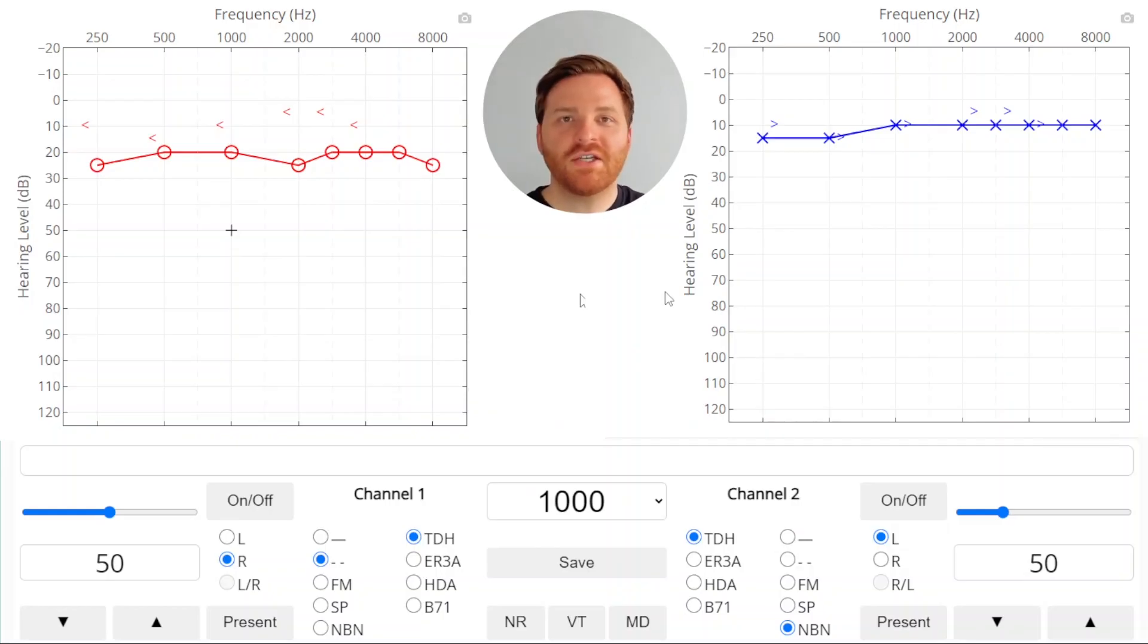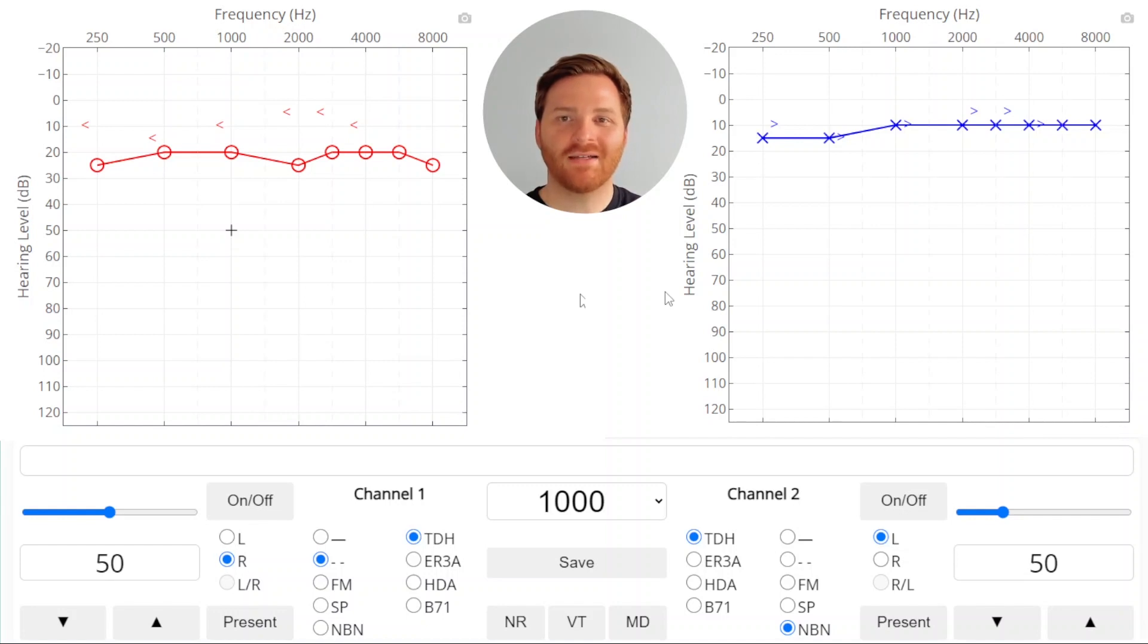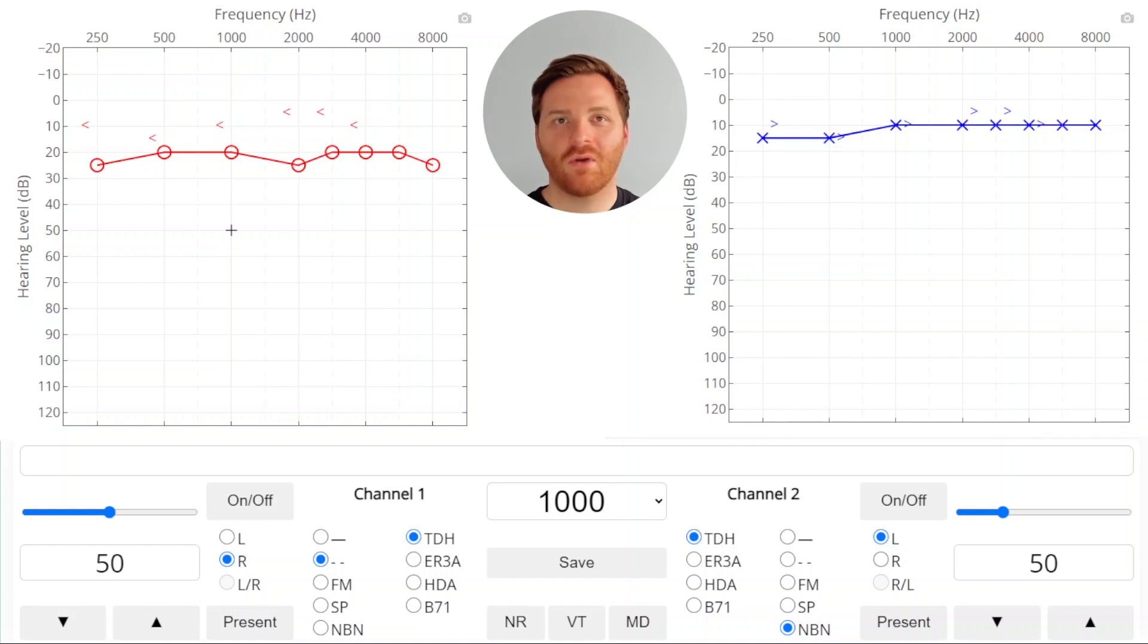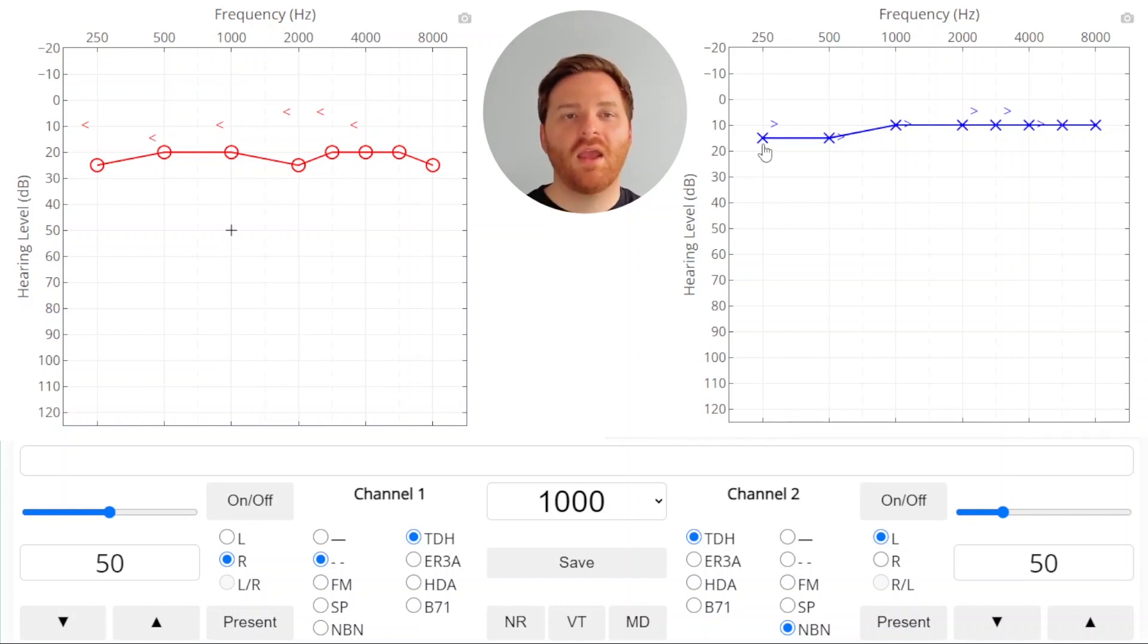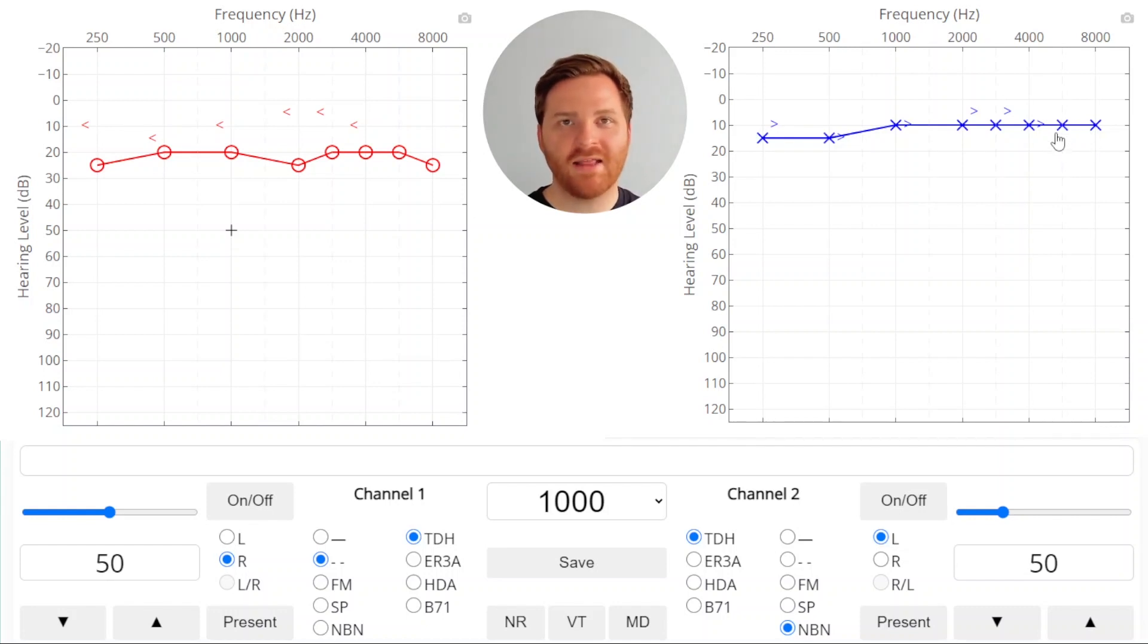So the first thing we need to do is figure out when we need to mask. If you have more questions about knowing when to mask, please check out one of our other videos that highlights that. But in short, you need to mask whenever there's an air bone gap greater than 10 dB, or you can think of it as finding a 15 dB air bone gap or more. The left ear that has better hearing has all of the bone conduction thresholds within 5 dB of the air conduction thresholds, so we don't need to mask anything by bone conduction in the left ear.